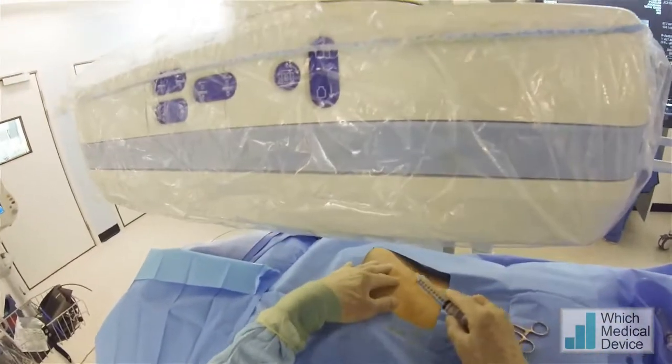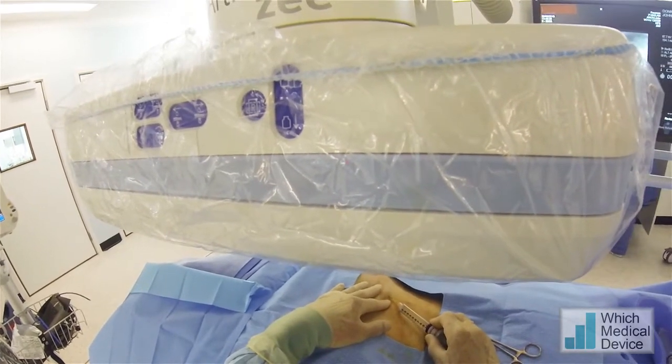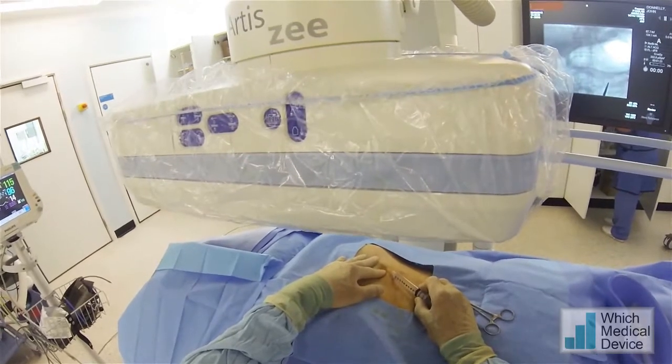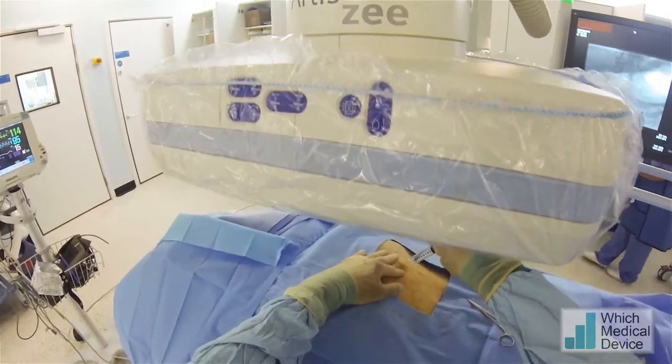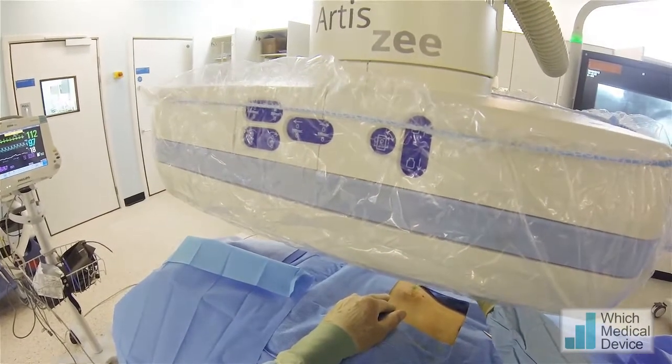It'll be a sharp scratch — this is local anaesthetic. A little bit of a sting. Is that alright? I'm going to do that in three places. Well done.